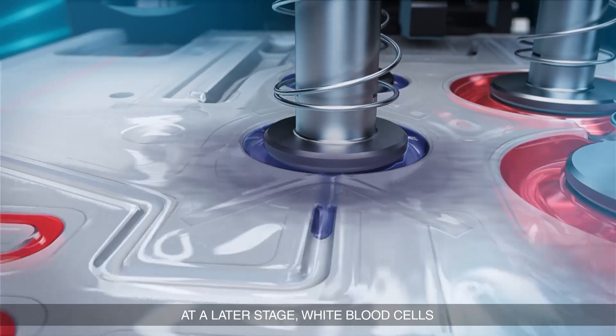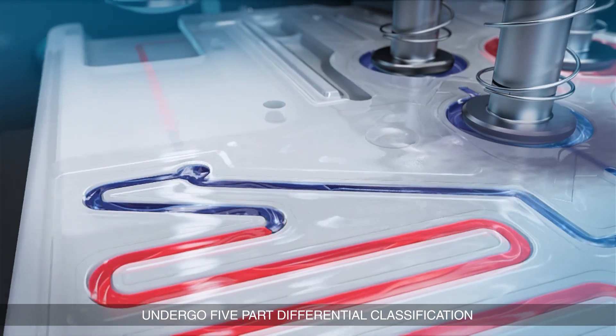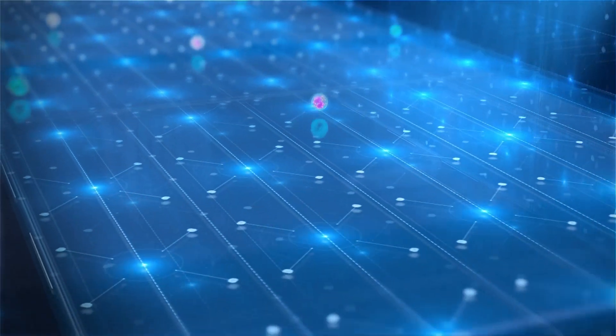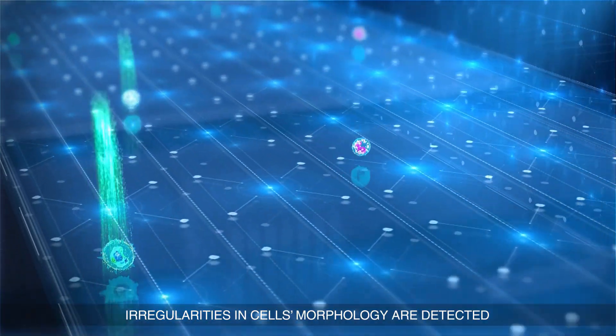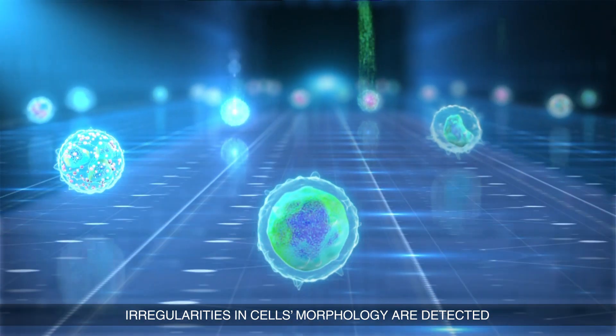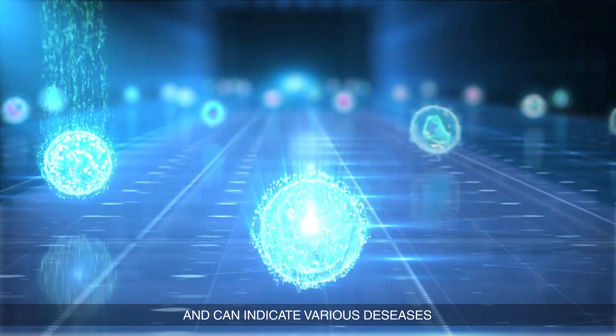At a later stage white blood cells undergo five-part differential classification. Irregularities in cell morphology are detected and can indicate various diseases.